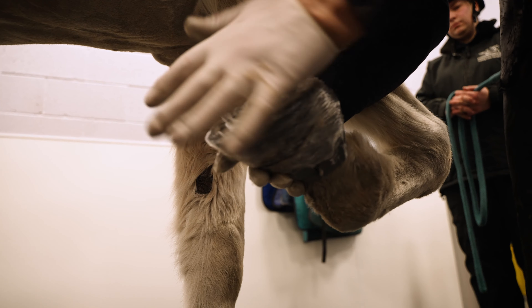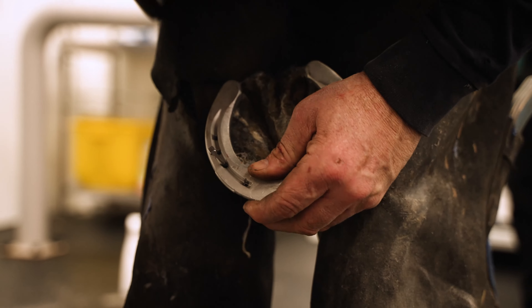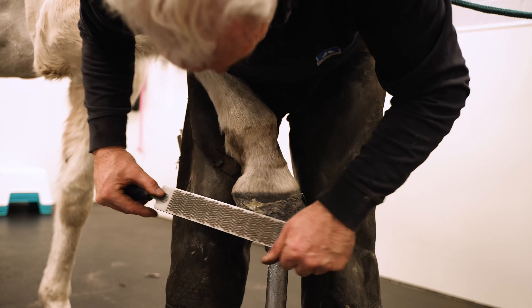When the cling wrap has been applied, place the hoof on the ground and repeat the process on the second hoof. Once the hoof cast has been set, remove the cling wrap and remove the central frog section of the cast so the hoof can expand and contract as normal.